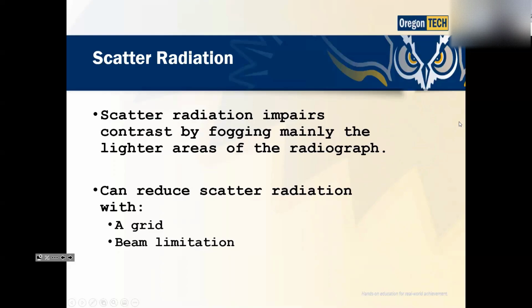The two tools that you have as a radiographer to control scatter reaching the image receptor, number one is going to be collimation. I want to collimate tight. I'm not going to produce as much scatter that way. Clean up that scatter mess with a grid. A grid does not have any effect on scatter production. It has an effect on the scatter reaching the IR.